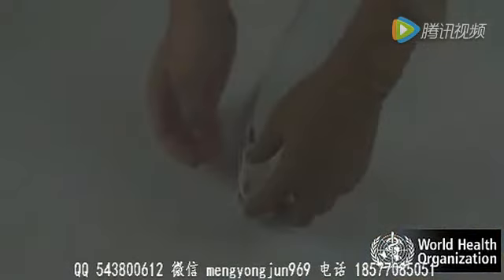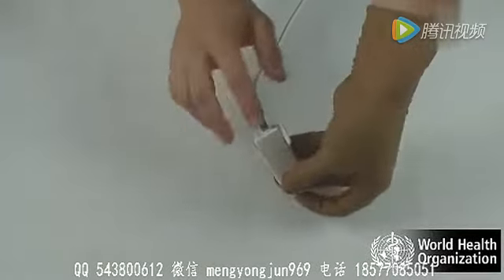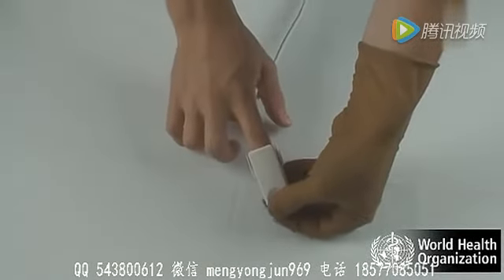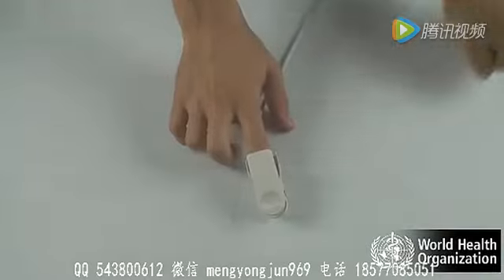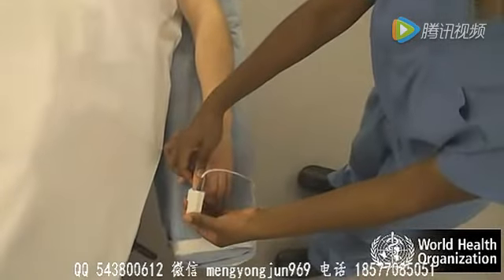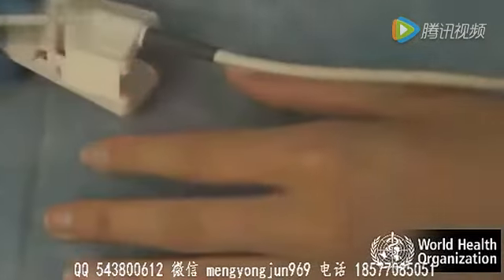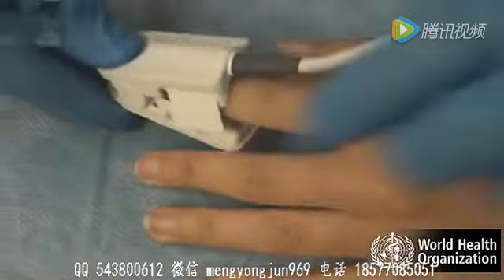Learning point: the function of the oximeter probe can be checked by placing it on your own finger. If no signal is obtained on the oximeter after placing the probe, check the following. Is the probe working and correctly positioned? Check that the probe is emitting a red light and try another placement site.